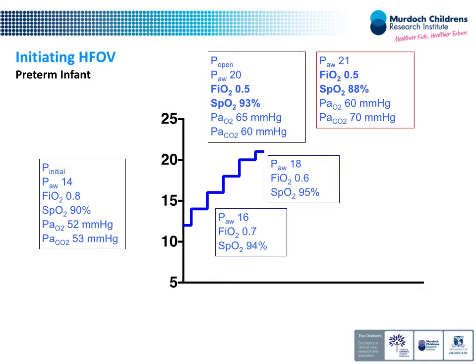Now we're staying about 2 minutes at each step in this baby. So we're going quite quickly relative to what we normally do at the bedside. And I'll show some data as to why we should do that. And now we have, I think, firm evidence that the increase in mean airway pressure is detrimental to this baby. We have got some bang for our buck. We have changed mean airway pressure and got the baby better. But now we're making the baby worse. There is no benefit to this baby in further increase in mean airway pressure.